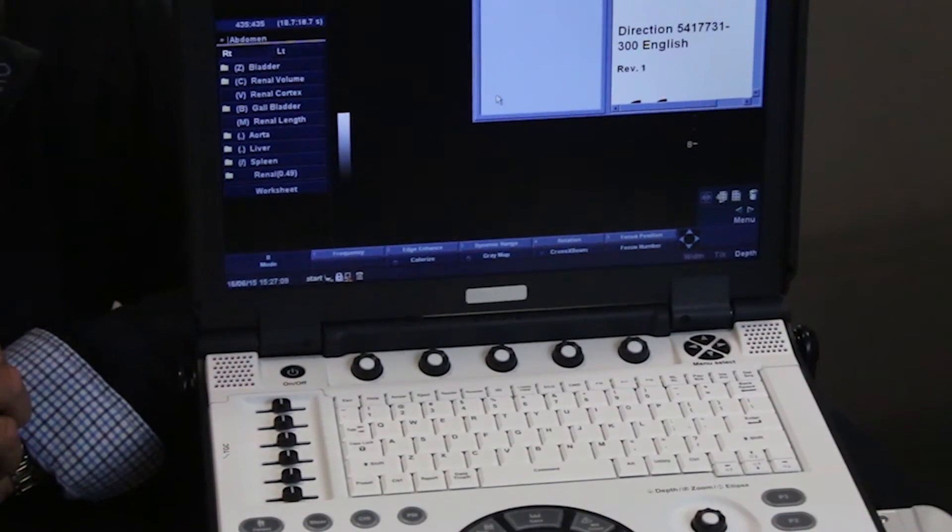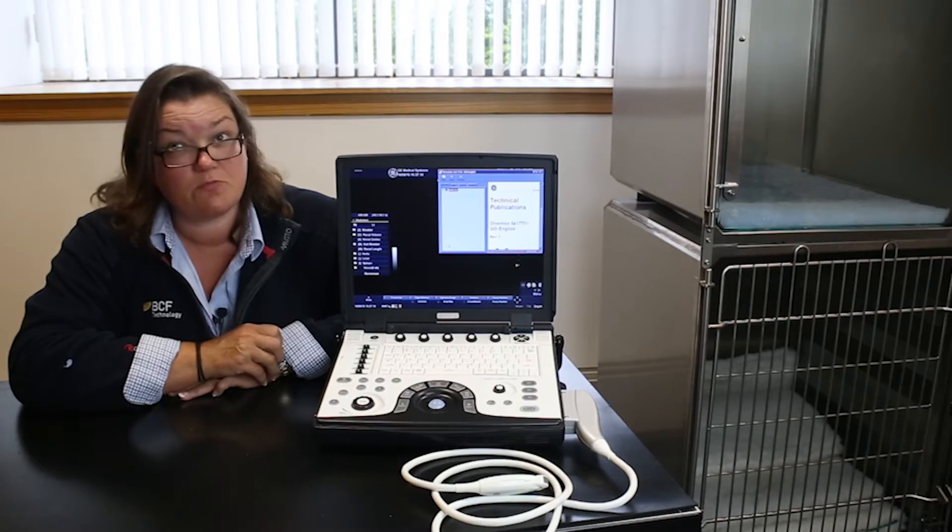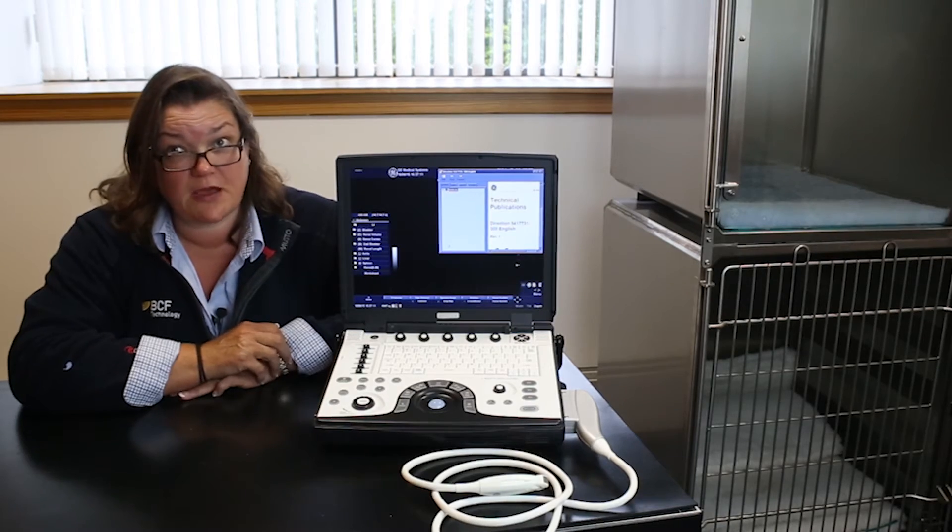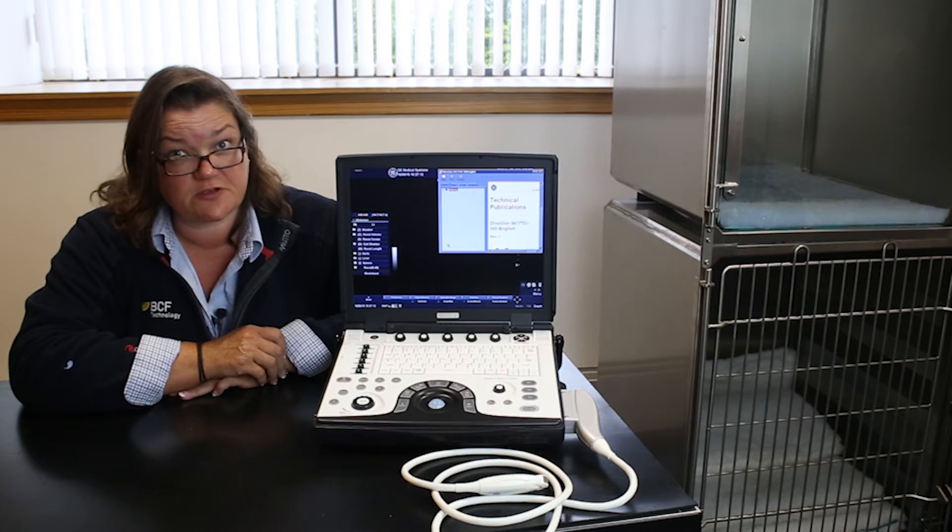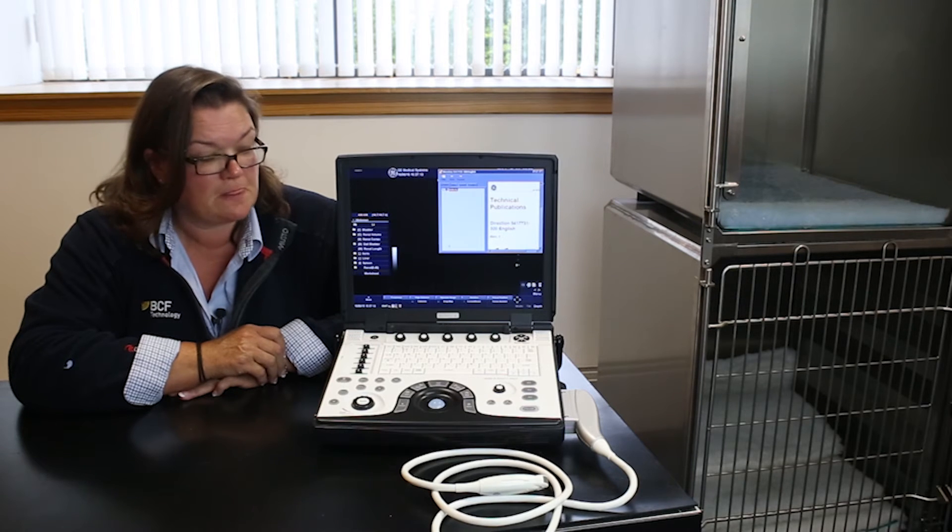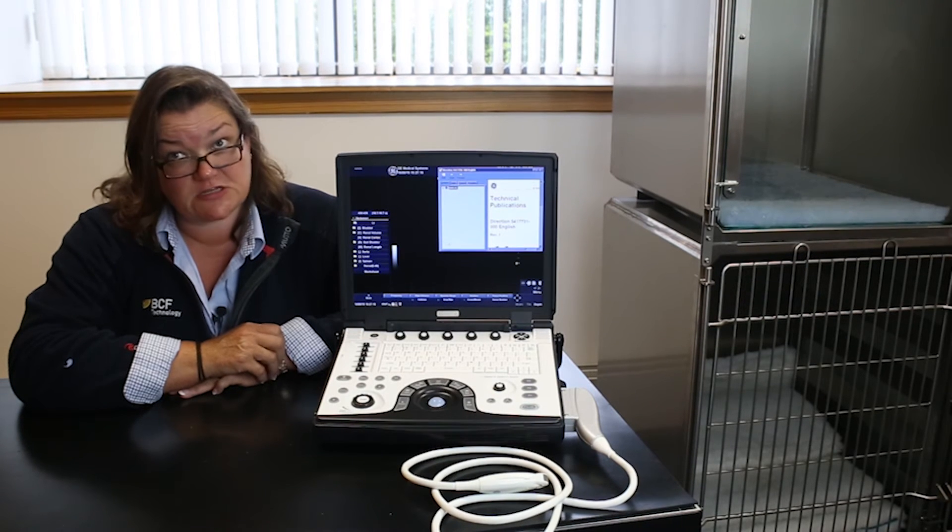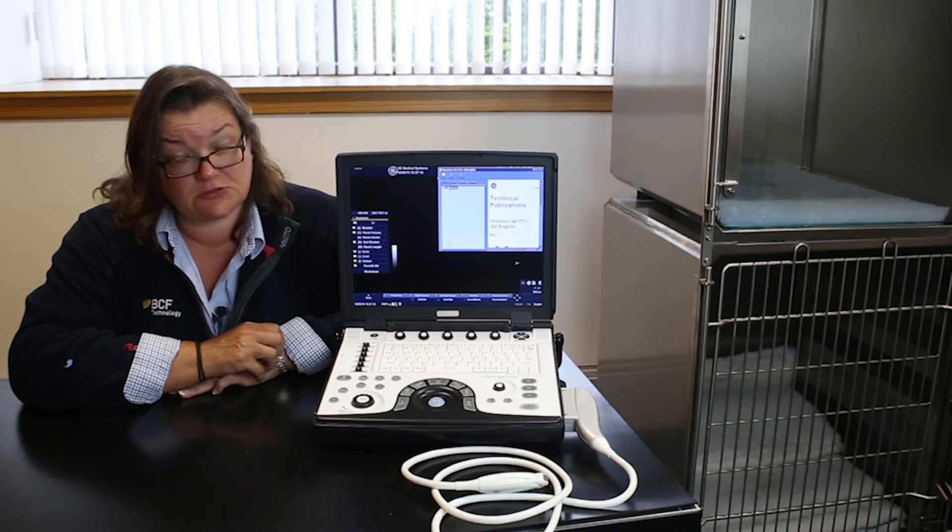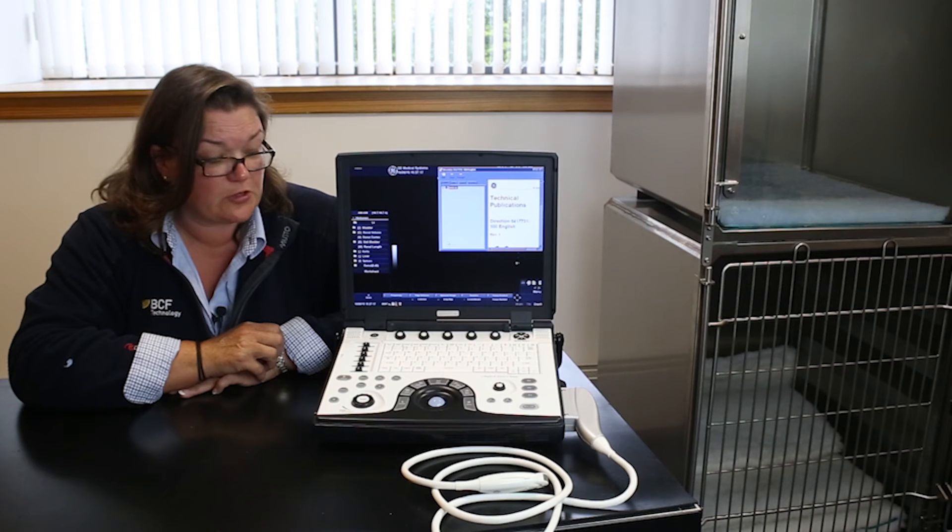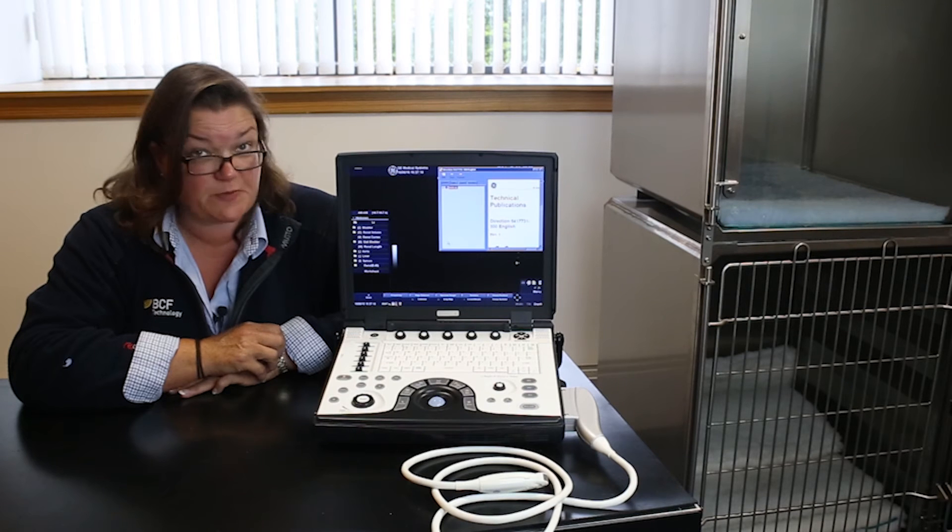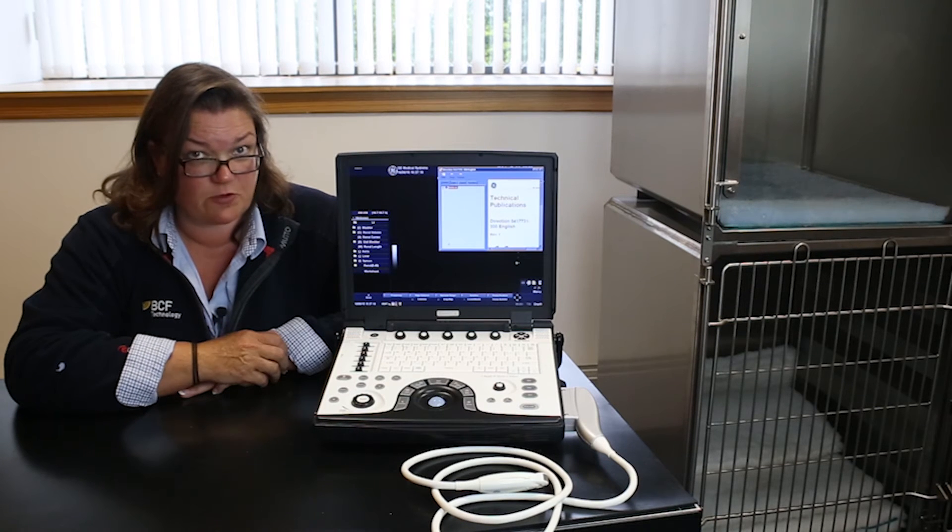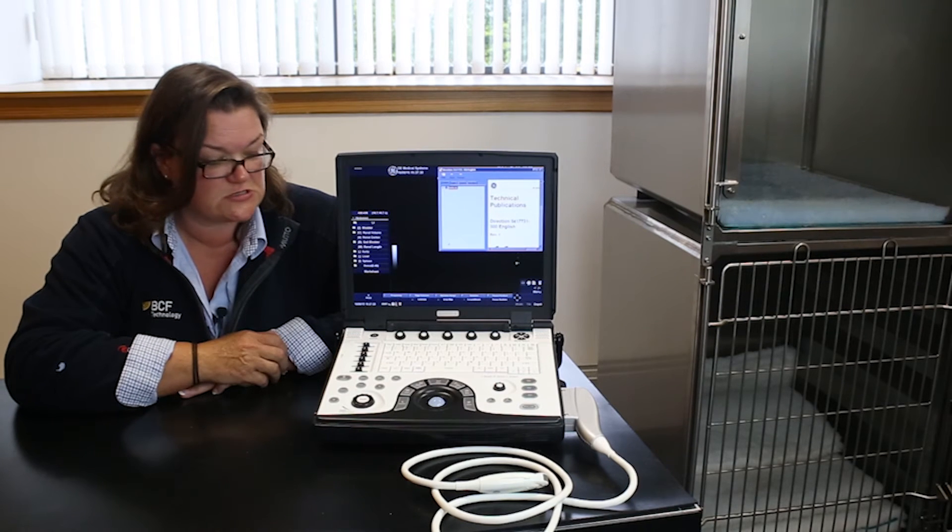You can put in any term that you want to know more about in the search function and it will take you directly to the part of the manual that will explain exactly what that function does.